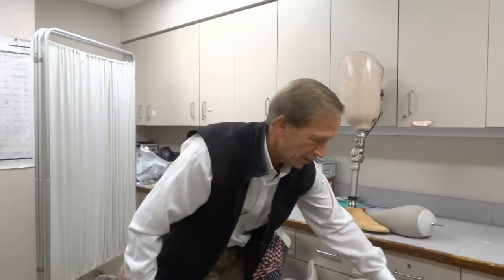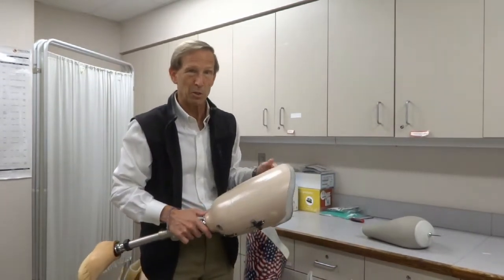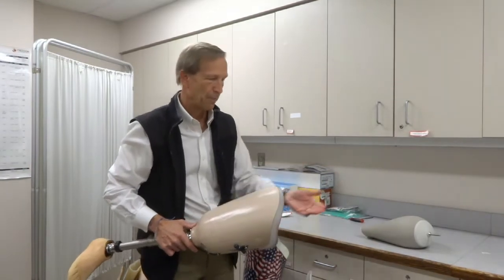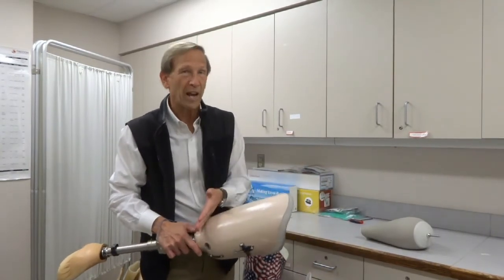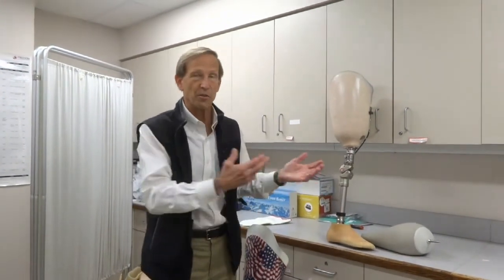Many people won't tolerate direct skin contact, or will only tolerate it when younger, not older. Anytime you switch from one suspension to another, it likely means changing the whole socket, because each socket is designed for a specific type of suspension — whether a pin, a strap, a seal-in with vacuum, or no gel liner at all. You and your prosthetist need to discuss what's the best design for you, based on how much soft tissue you have, how much cushioning, how tender your limb is, how active you'll be, how much volume change there is, and how much your limb tends to swell and shrink.